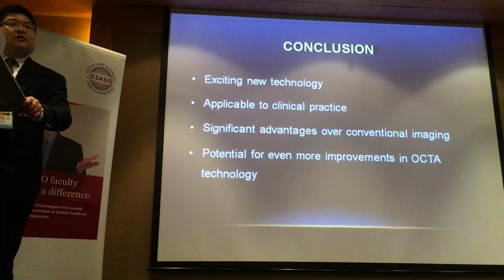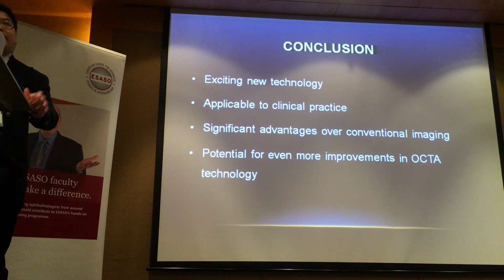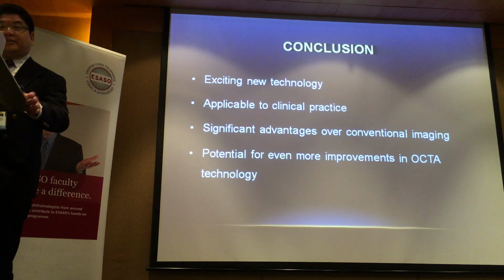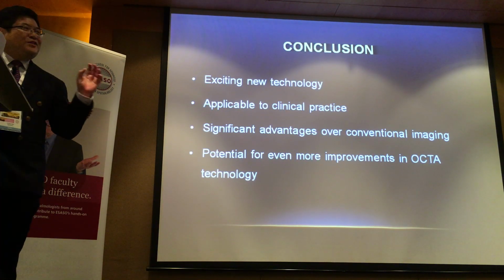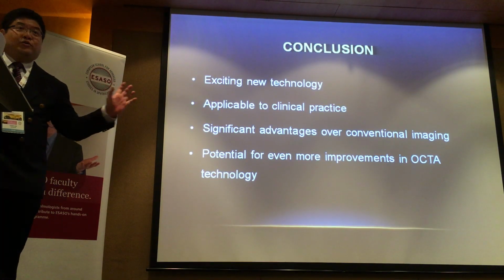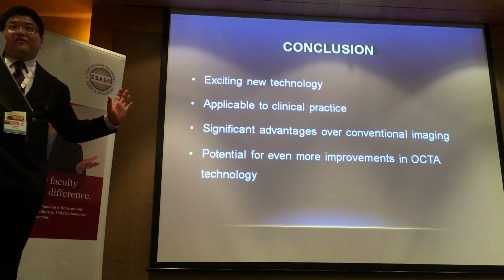And the finding was extensive ischemia. Please go ahead and do a PRP. So I said, well, okay, do you want me to have a look? I can have a look. I called up the image, and I should have kept an example of that. There are other examples. Yes, it was dark. You don't see the vessels that you see on what I showed you. These are the best examples of what we have.